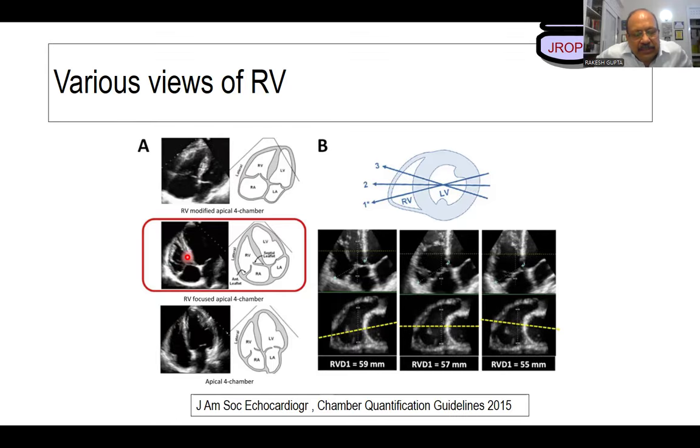What I always do is go a space a little bit up, in the fourth intercostal space. Keep my LV apex in its normal position, and then try to focus on RVRA. With slight anterior angulation, the footprint looking toward the right shoulder tells you the aorta opens up over here. If my aorta is opening over here, I see this picture, I close my aorta, and this becomes RVRA focused. It will come with experience.